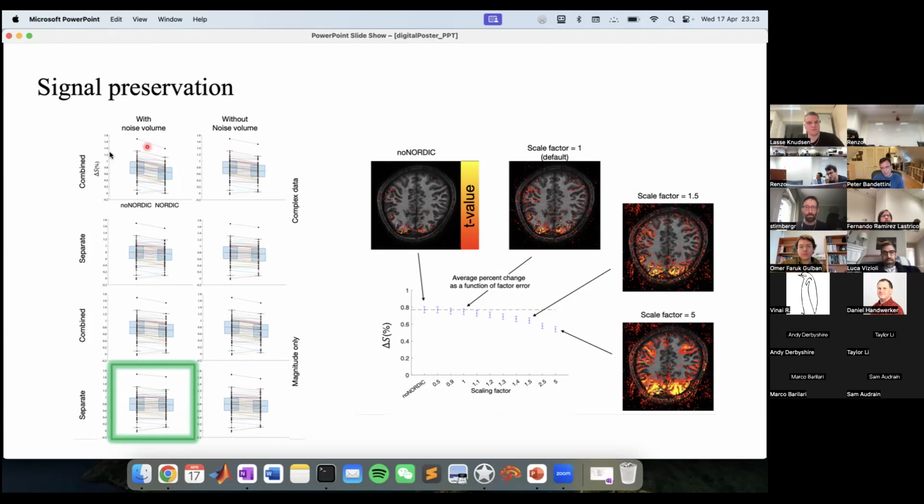Well, obviously with ISMRM and stuff, one thing that we can try to do is remove different numbers of components in K space depending on where you are in K space. So in the middle of K space, you know that you've got low frequencies, so you can get away with higher removal, and at the edge of K space, higher spatial frequency, so maybe preserving more components, removing less. Less aggressive removal on the edge of K space and more aggressive removal in the middle of K space. So kind of like an adaptive removal in K space as opposed to image space.